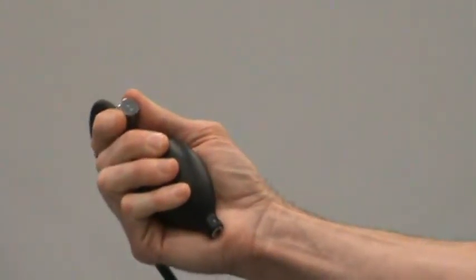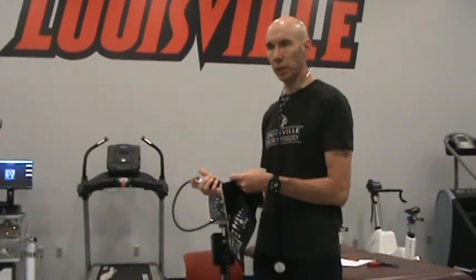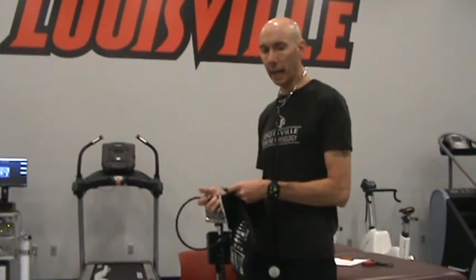Once I get it up to where I want it to be, I then immediately open the valve very slowly. The opening and closing of the valve is another skill that really is required to practice pretty often. Once you get a feel for it, it becomes easier to assess the blood pressure more accurately.